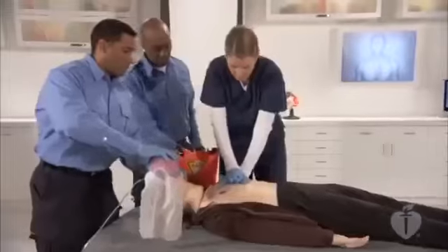Shock delivered. Begin CPR. Start with compressions.